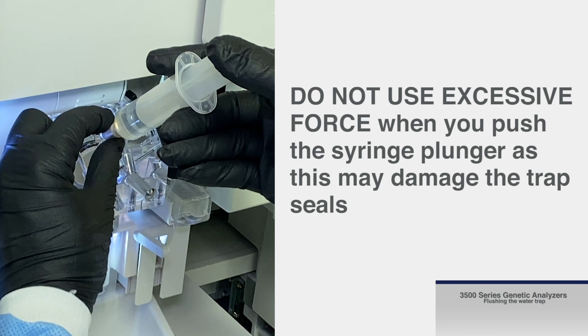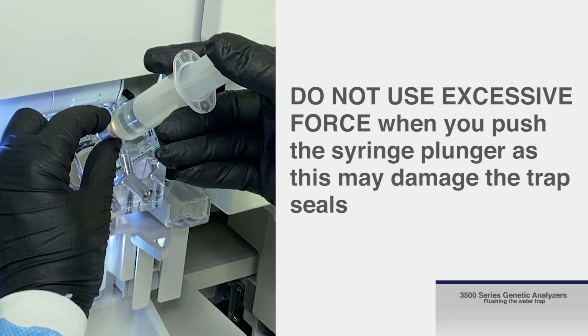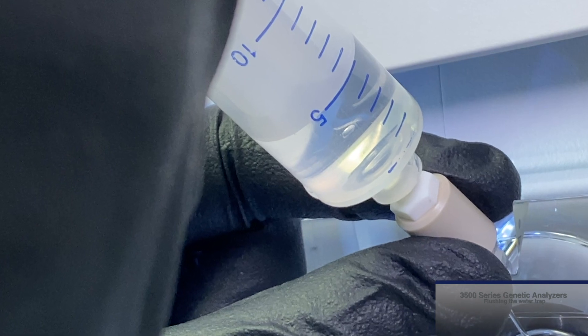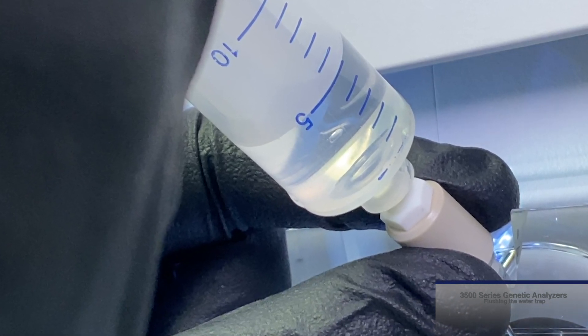Do not use excessive force when you push the syringe plunger as this may damage the trap seals. Take approximately 30 seconds to flush 5 milliliters of either distilled or deionized water through the trap.